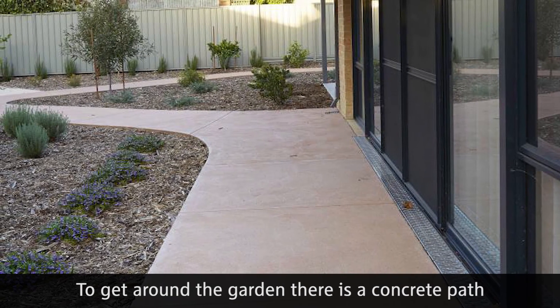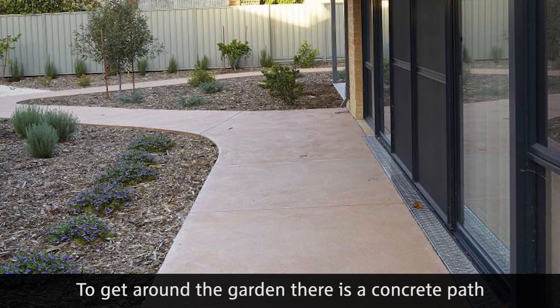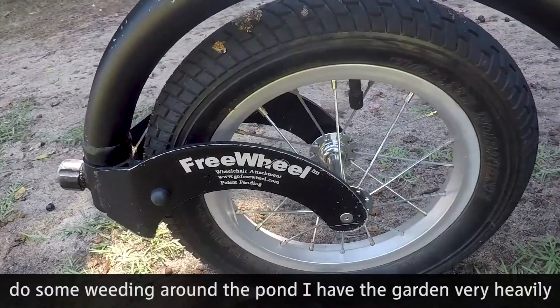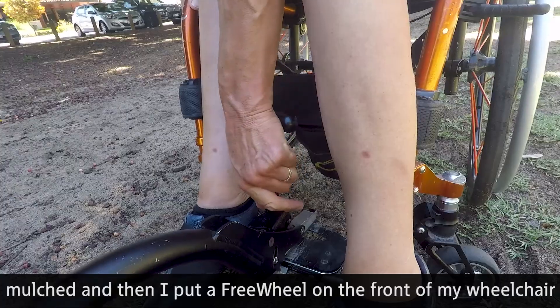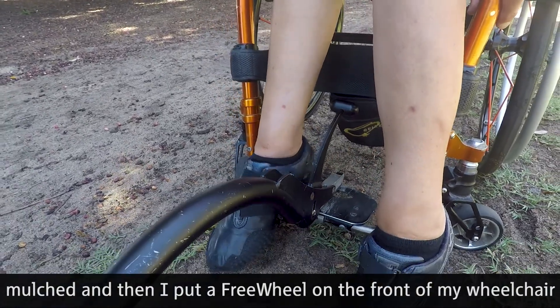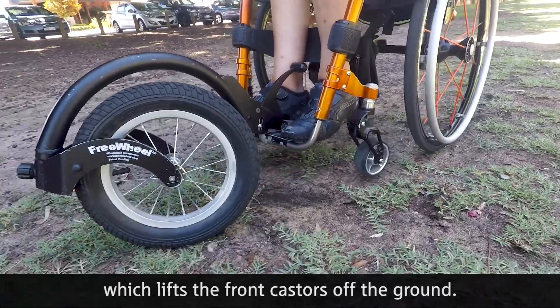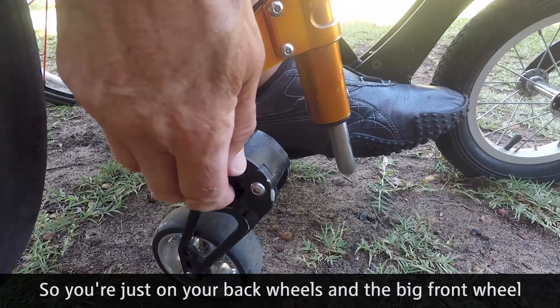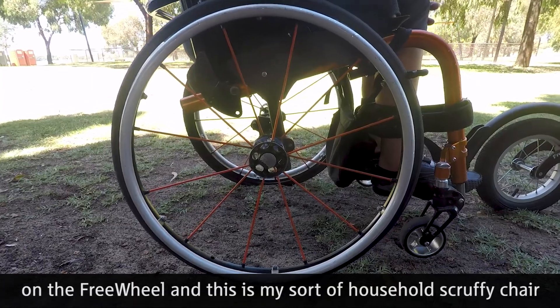To get around the garden there is a concrete path, but to get into the far corners and do some weeding around the pond, the garden is heavily mulched. I put a freewheel on the front of my wheelchair which lifts the front casters off the ground, so you're just on your back wheels, the big front wheel, and the freewheel.